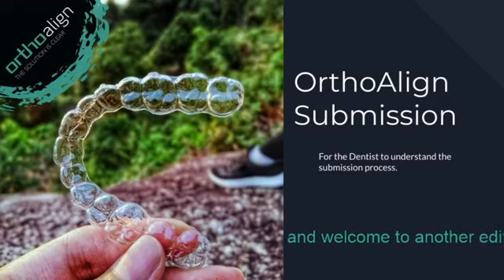But we are not only limited to intraoral scanners. Again, impressions, the traditional way, we can also accept all kinds of impressions. We definitely prefer the silicone type and try to avoid the alginate type, because we are not going to be able to re-pour the model or re-pour the stone if anything were to happen with the alginate impression or the stone that was poured by you.